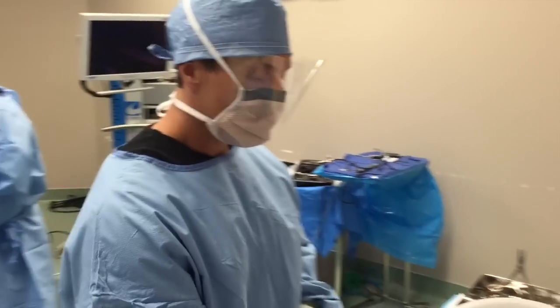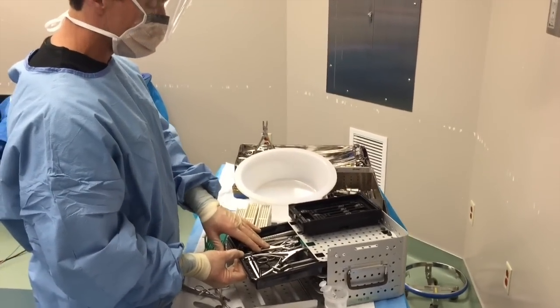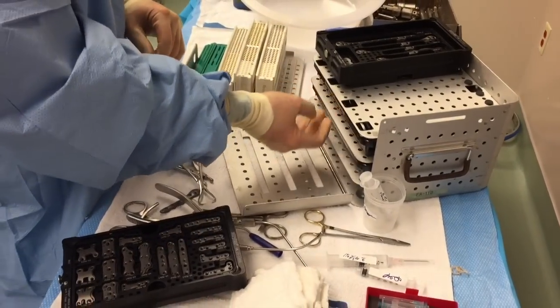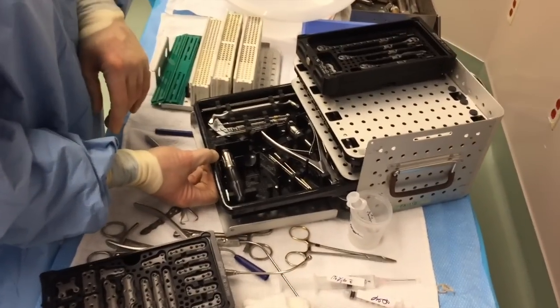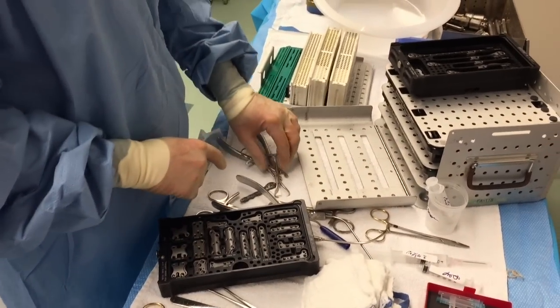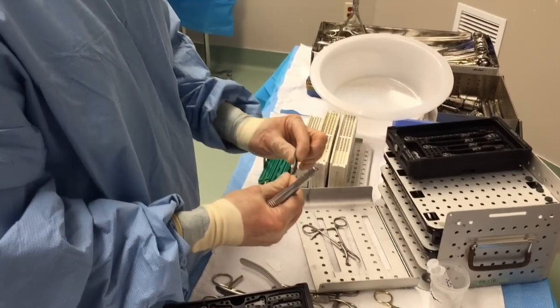This is a full kit. Inside here it has compression clamps, different types of spreaders, tissue guides to protect the soft tissue, and down here different reamers and screw sets, wire cutters. So it's a complete set, and we have a couple of bending apparatuses here because I'm going to take the plate and actually tweak it forward.